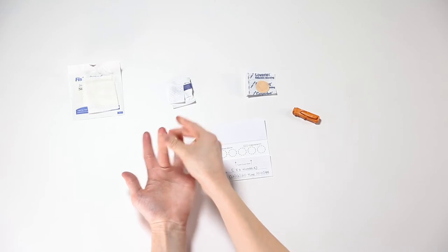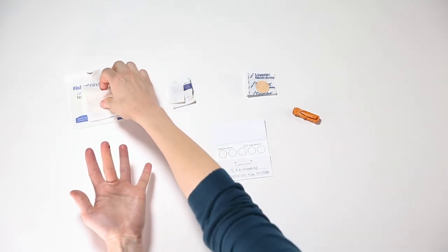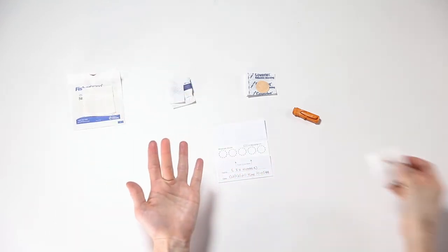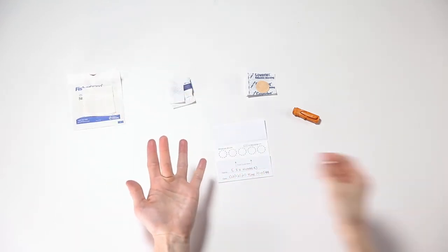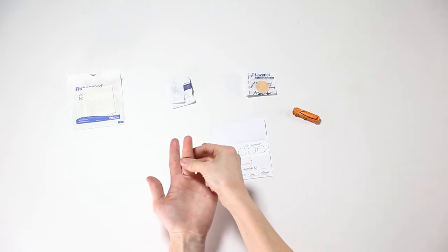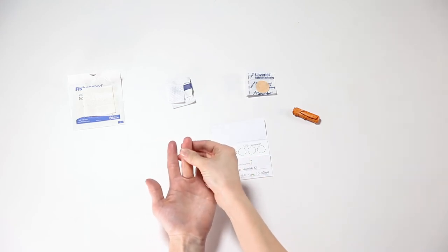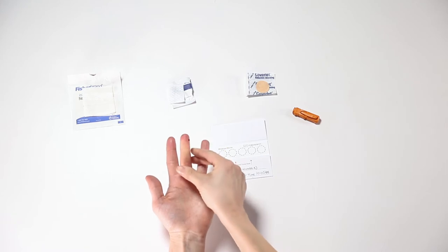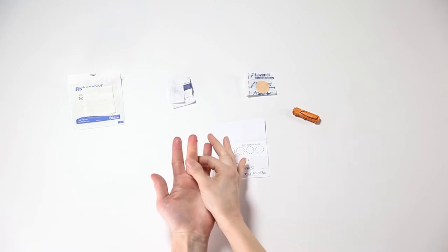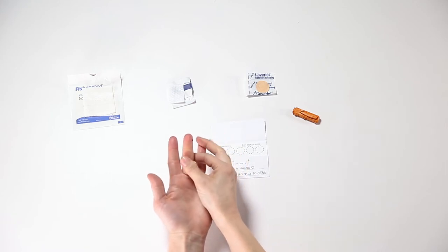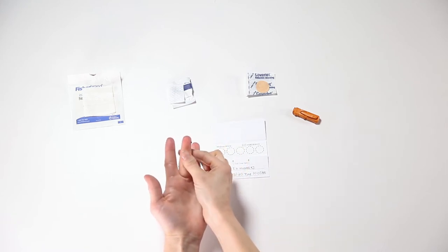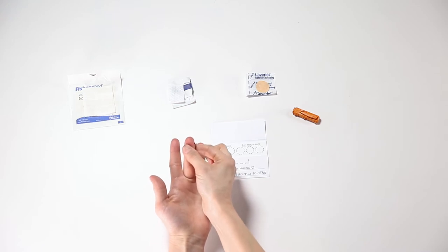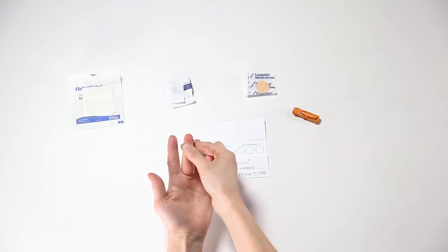Wipe the first drop of blood with the gauze. Gently massage the finger, moving towards the tip to encourage blood flow. Be sure to avoid excessive squeezing or milking of the finger, as this will dilute the sample. If blood flow is still not sufficient, the finger stick may be repeated on a different location.